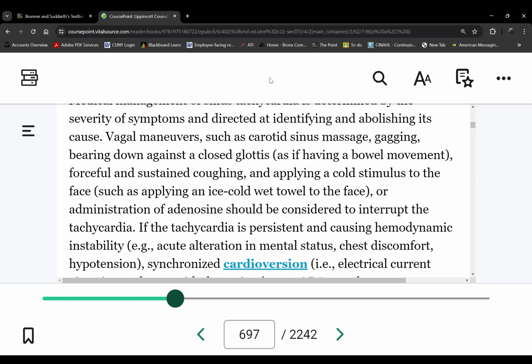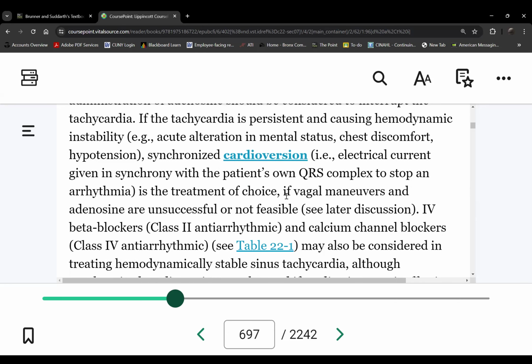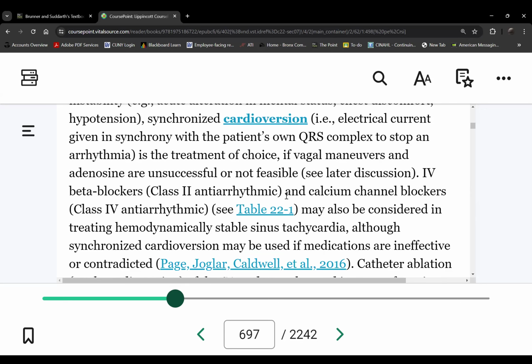The physician usually is. But make sure you have the 3-way stopcock. The doctor can't do it without one, unless there's Flash. You know who Flash is? The Marvel hero? Marvel's Flash probably doesn't need a 3-way stopcock, but we're not Flash, so we need a 3-way stopcock. So if you're ever charge nurse for the day, make sure you have a 3-way stopcock somewhere. It's embarrassing if you have this emergency and you just need that one lousy attachment, and you don't have it, which can cost the patient's life.